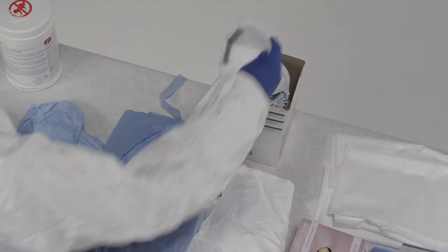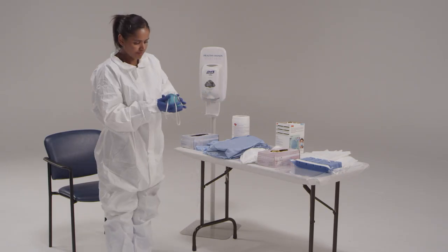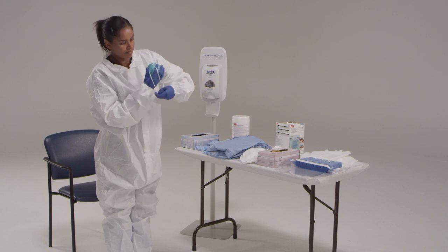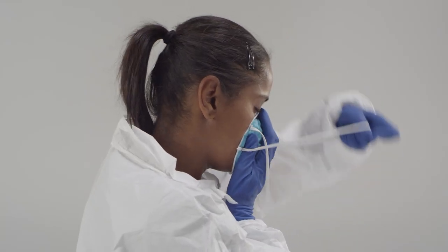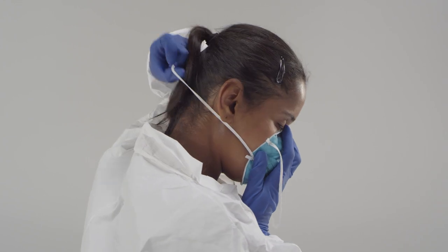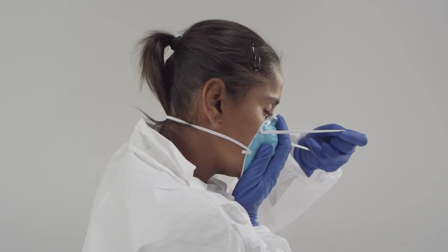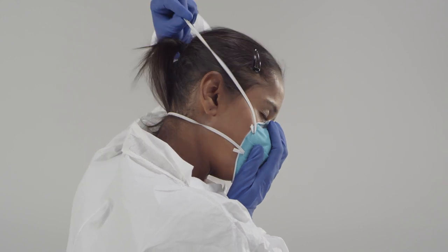Now put on the N95 respirator. Hold the respirator in the palm of your hand with the straps facing the floor. Place the N95 respirator on your face, covering your nose and mouth. Pull the bottom strap up and over the top of your head and put it behind your head below your ears. Take the upper strap and put it behind your head towards the crown of your head.